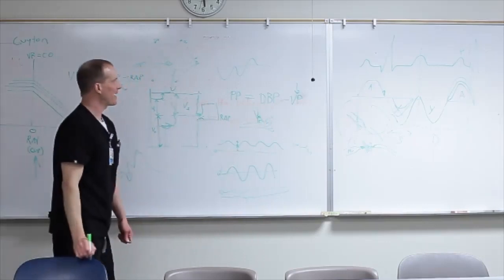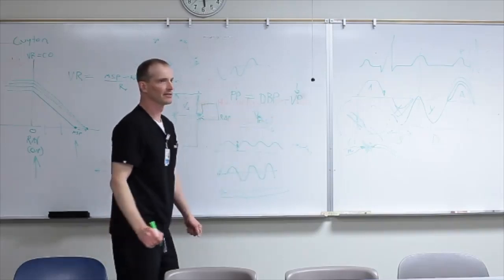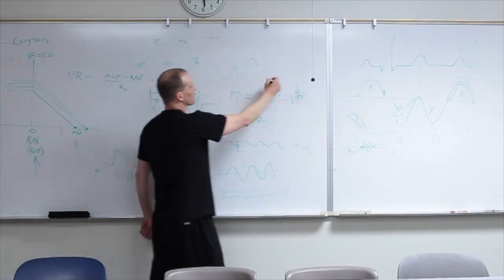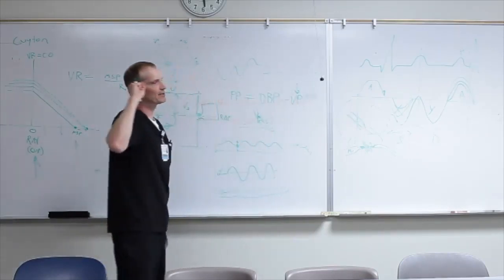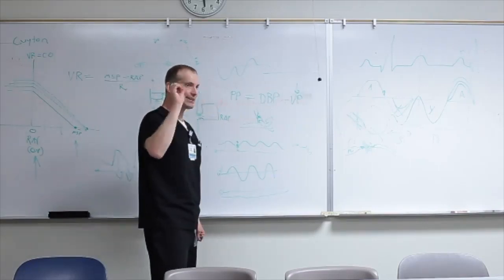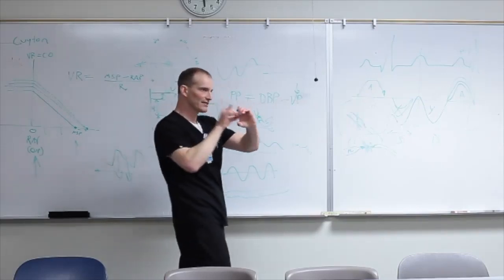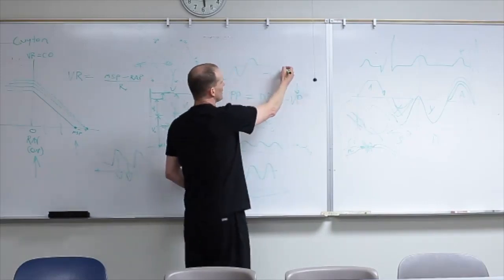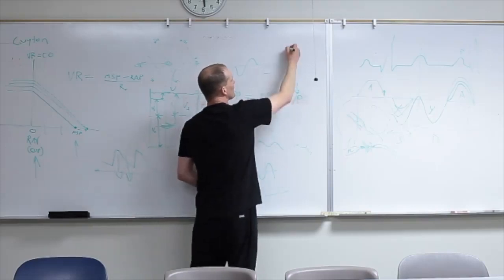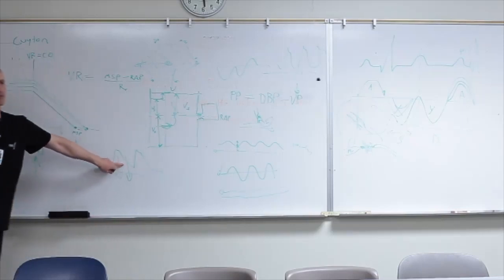What about a hepatic artery? Because it's going to be in the same neighborhood as the portal vein too. Blue, red, blue, red. Actually, what'll happen is it'll flash red, red, red, and if it's aliasing because you exceeded your Nyquist limit, you'll be red and flashing blue in the middle. I think you guys have seen that. And if you don't know what I mean by Nyquist limit and aliasing, don't worry. But you'll see this. It'll look just like the arterial stuff going on.